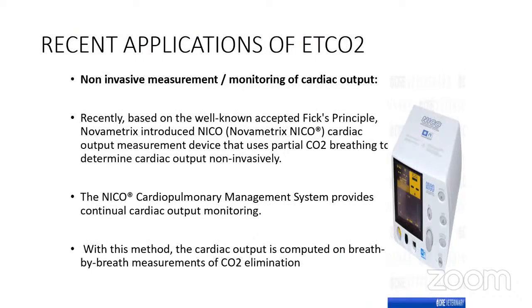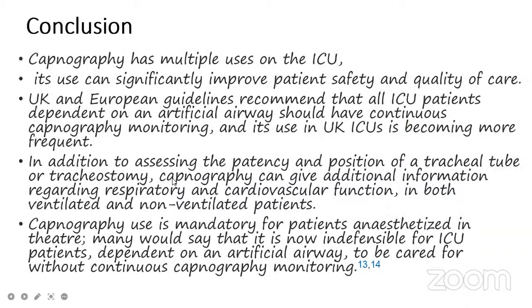The recent application is a non-invasive measurement, used in the NICO cardiopulmonary management system, which provides continual cardiac output monitoring. This helps with breath-to-breath carbon dioxide elimination monitoring during resuscitation.